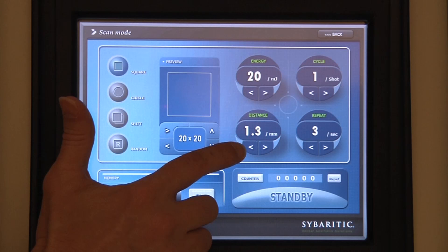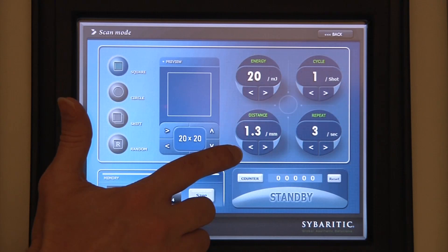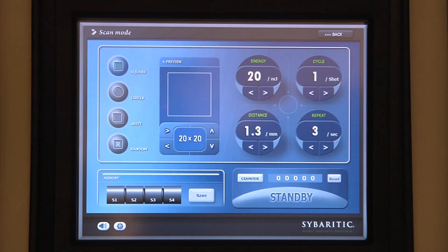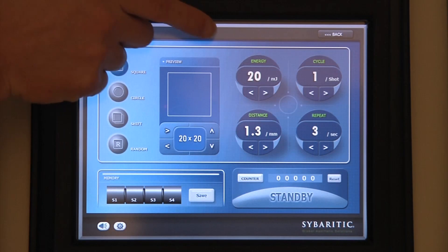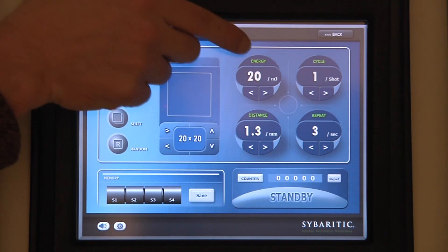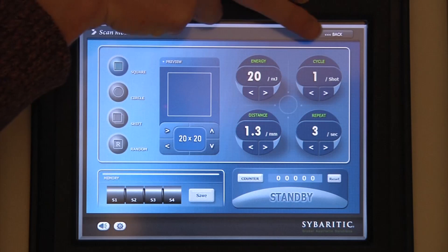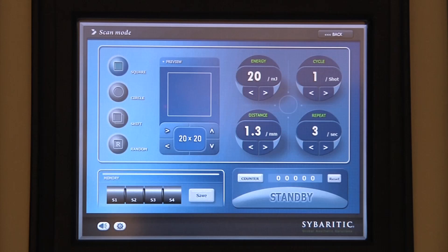The spot distance I would use in these cases is in the range of about one to one and a half millimeters between spots at a moderate energy setting. As I move from simple skin textural changes to a more aggressive treatment of deeper wrinkles, I would not only increase the energy, but we also have the ability to increase the number of cycles that are fired going deeper into the tissue.